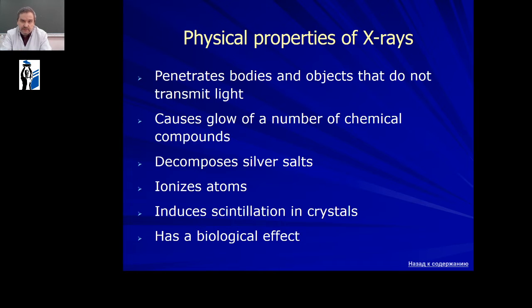What are the physical properties of X-rays? X-rays penetrate bodies and objects that do not transmit light. X-rays cause the glow of a number of chemical compounds. X-rays decompose silver salts. X-rays ionize atoms, induce scintillation in crystals, and have a biological effect.